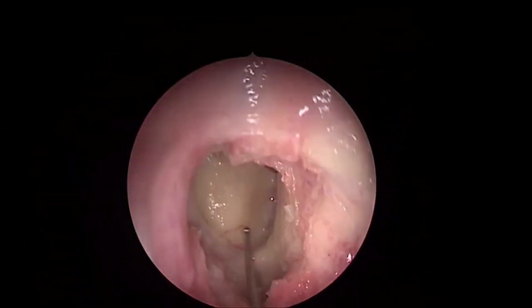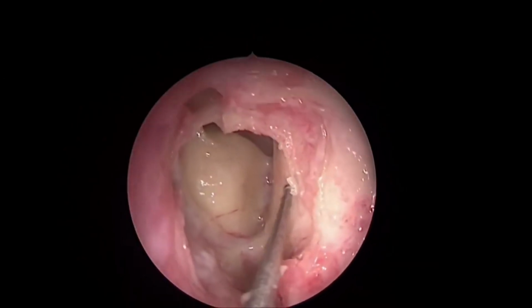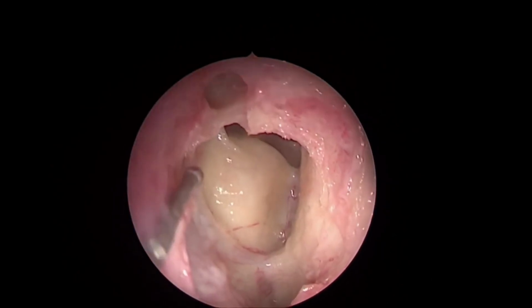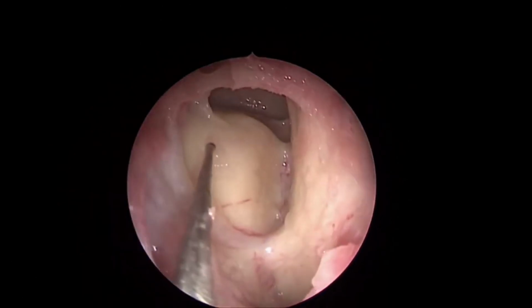Now, having done this wall I just showed you, it is important that you can't go beyond. The orbit is there. This you can't transgress, the skull base is there. Behind this is the posterior table, where the skull base is behind.